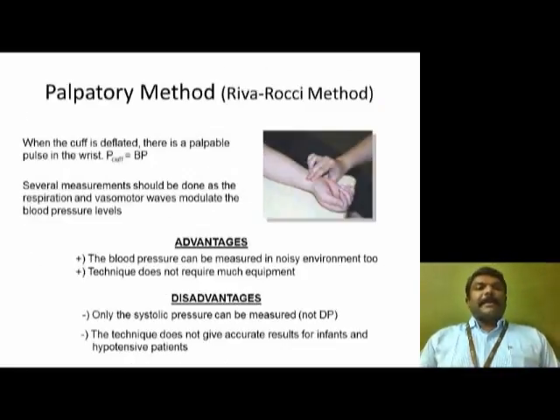This is the palpatory method, also called the Riva-Rocci method. In the Riva-Rocci method, as I told you, the doctor will be holding the pulse. There is no need of any stethoscope here. Here, it is direct touch. With the help of touch, they will be sensing the pulses.